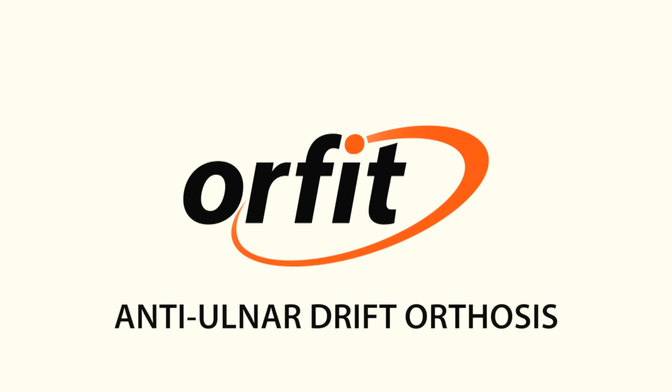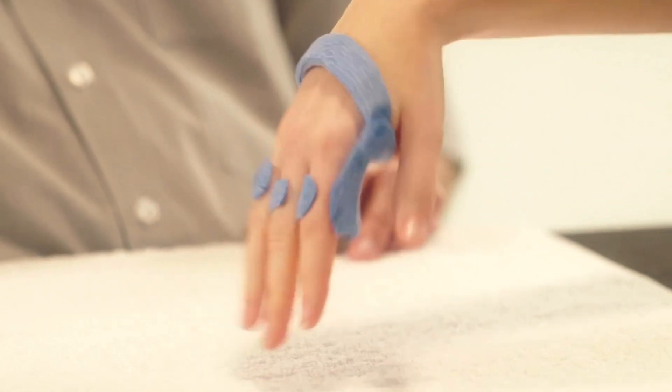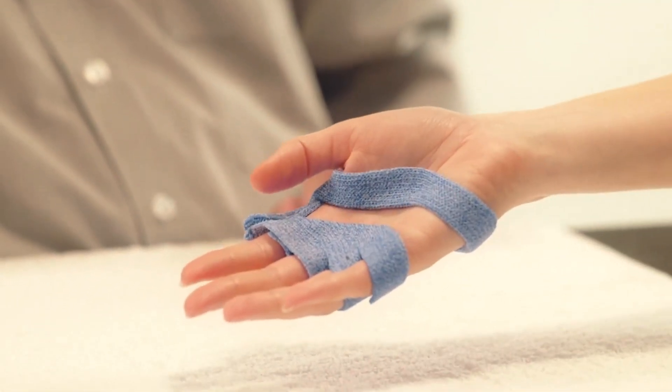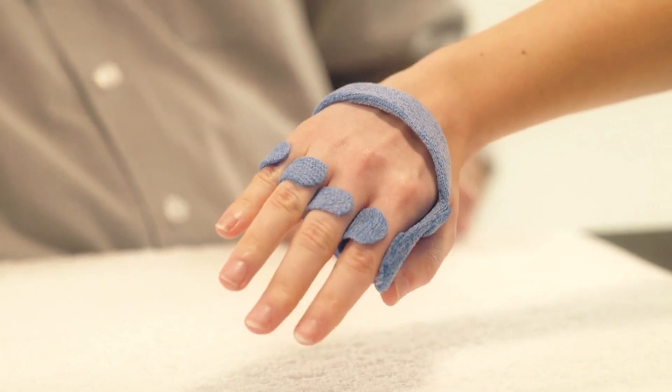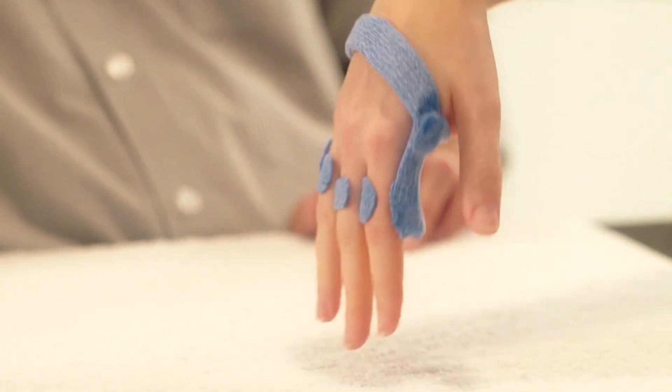Anti-ulnar drift orthosis. Here we will demonstrate how to make a functional orthosis for patients with ulnar drift of the MCP joints of the fingers.